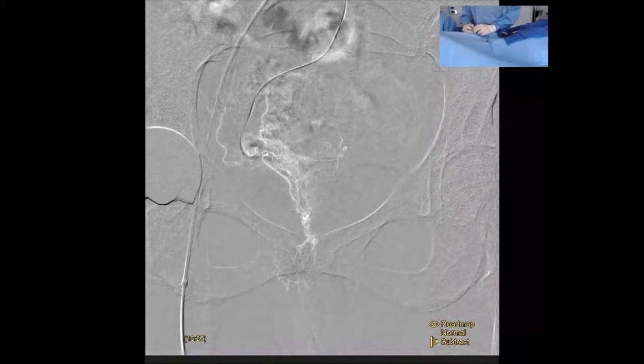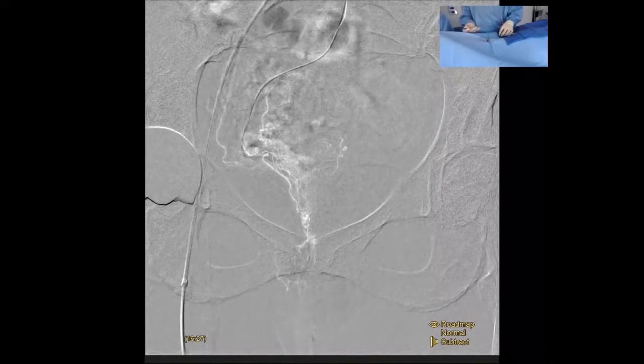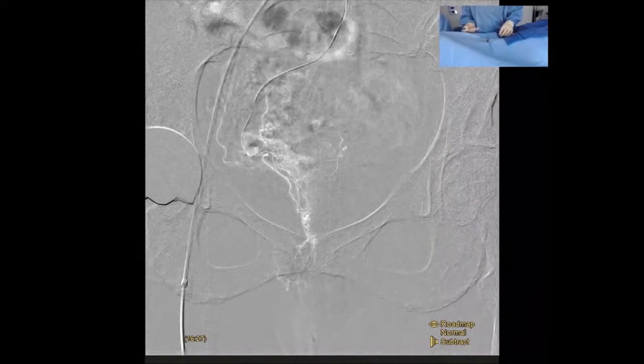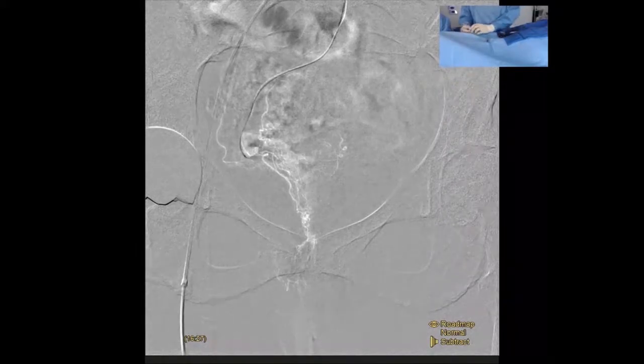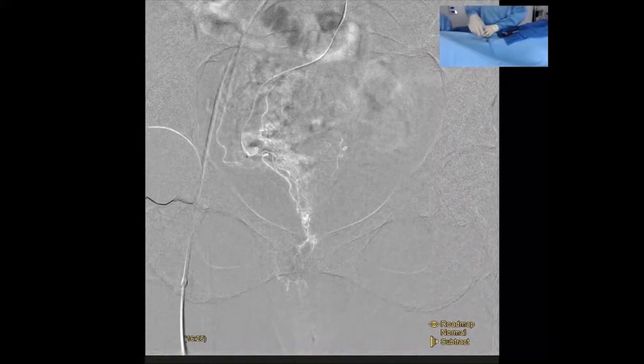And what happens here if you just push the catheter with the line? Yeah, so try that here and see. I think that it looks like no matter what, it still wants to go to that medial mucosal branch. And rather than honestly have spasm and go for something that can be more distal here, I'd say we're going to park a coil here.